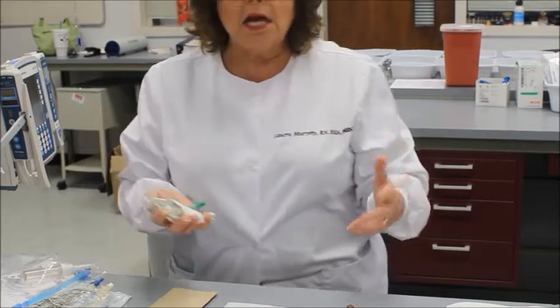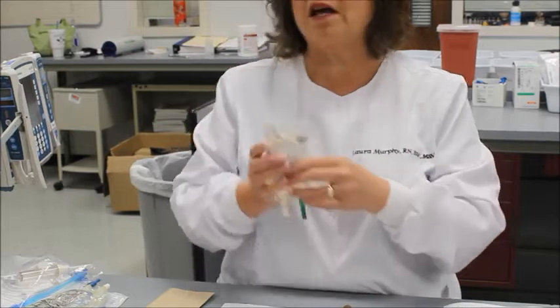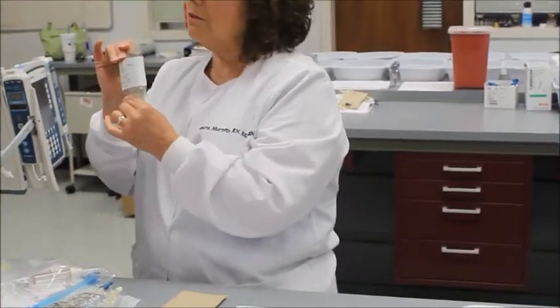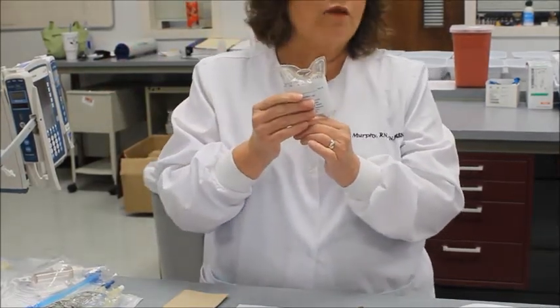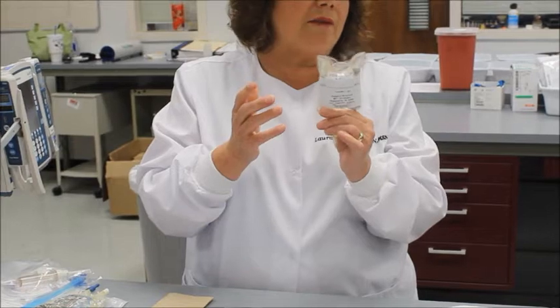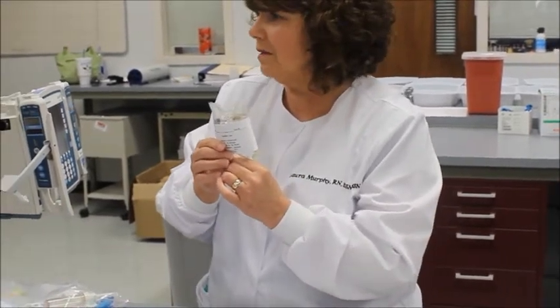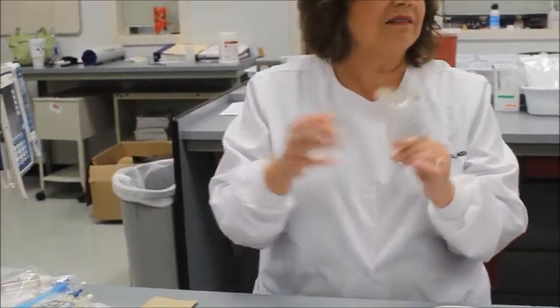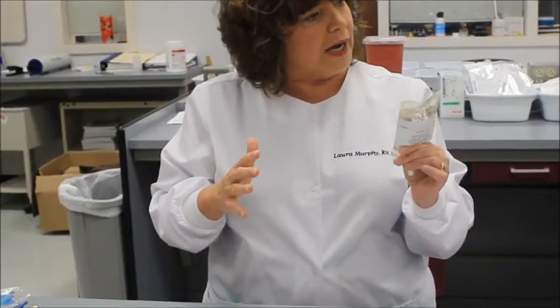Yes. Yes. Sometimes we make clinical decisions because this is only 50 mLs. That's less than 2 ounces, but it is going right into the intravascular space. If you're giving Cipro or Avelox, you're giving 250 mLs. For a heart failure patient, I may not want to run that in an hour, correct? So I could slow it down, correct?